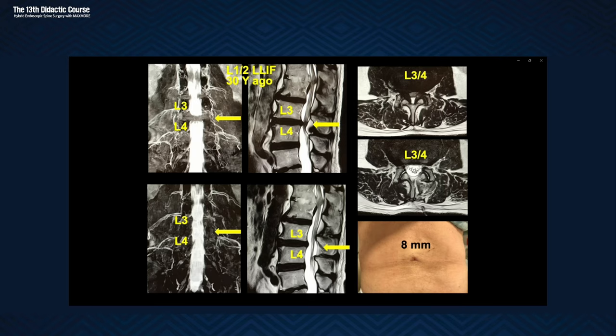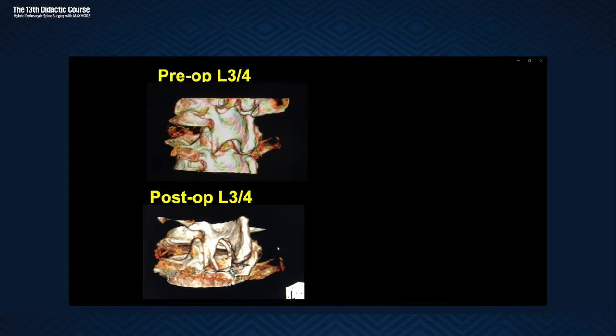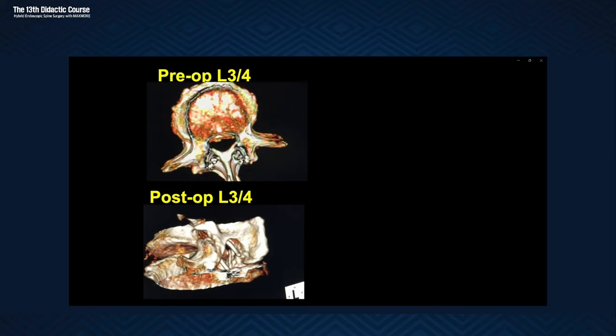The upper column is the MRI of my L3-4 spinal canal stenosis before surgery. The bottom column is the dilated dura after surgery. Only one 8mm incision. The operation time was 90 minutes under general anesthesia. 3D CT images before and after surgery are compared. The left half lamina is enlarged, and the drainage is set in a circle immediately after surgery.